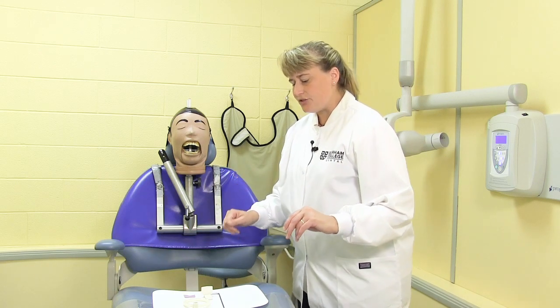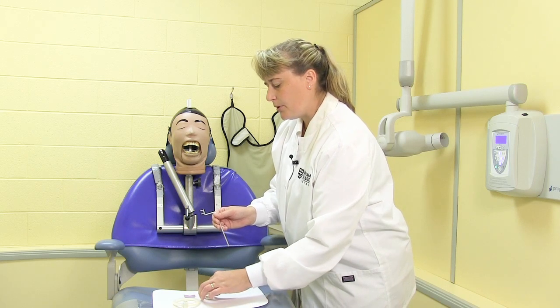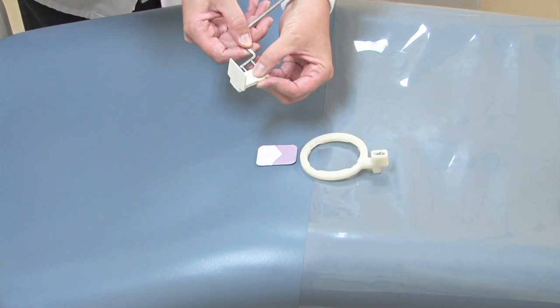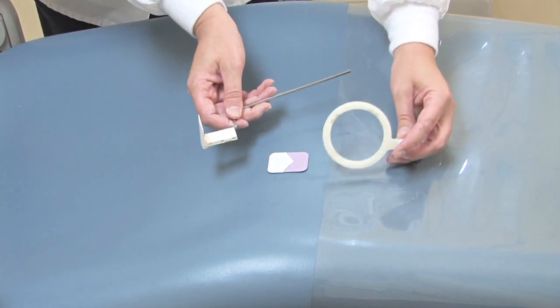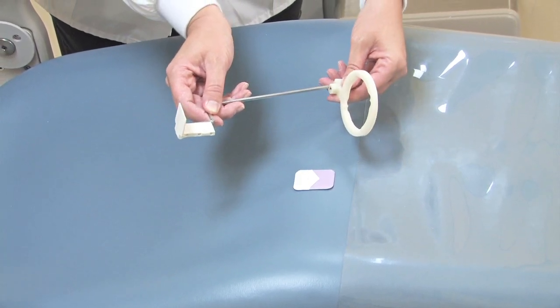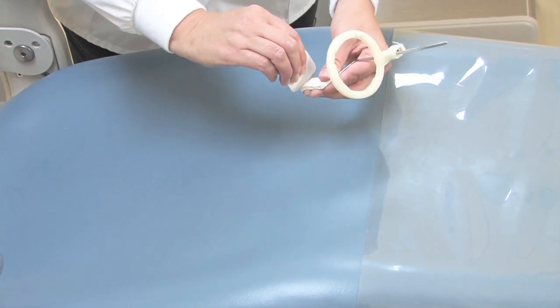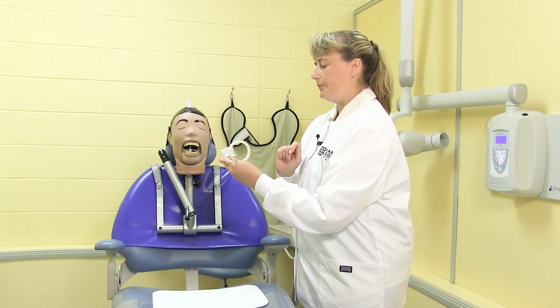I'll first get the instrument set up. I have the rod, bite block, and ring for the posterior. The rod is inserted in the side of the bite block, and the ring is placed so that the block is in the center. I'm using size number 2 film. The dot is placed into the slot of the bite block, and the tube side is toward the ring.